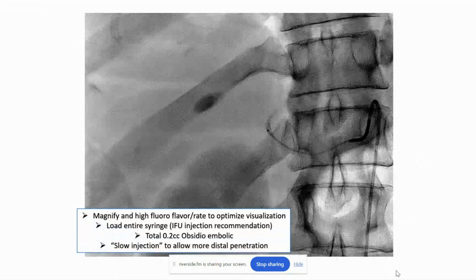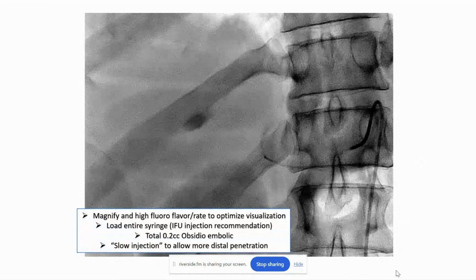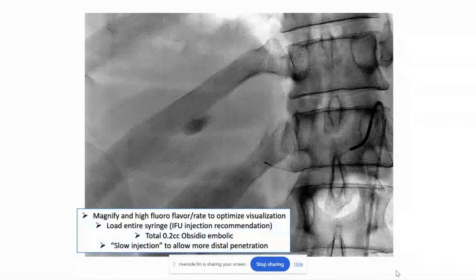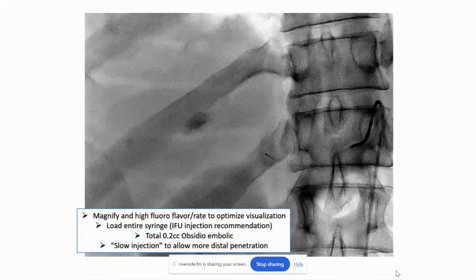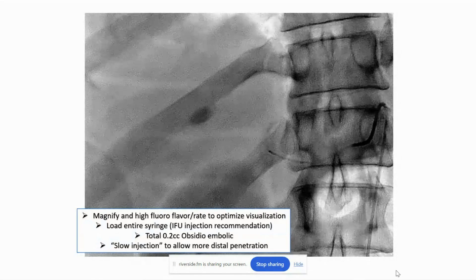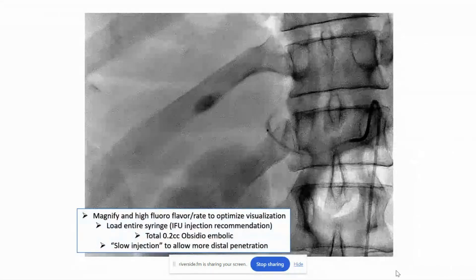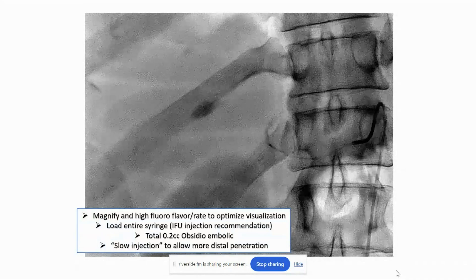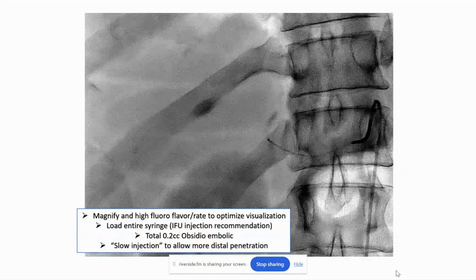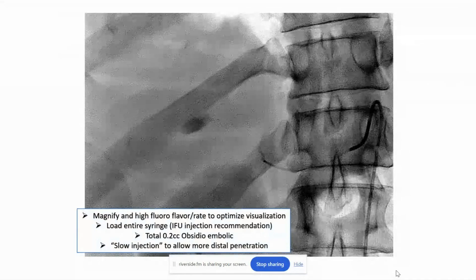So just the pearls: really want to magnify and use a high fluoro rate to optimize visualization. I typically use the IFU method for injection of Obsidio, which is to essentially load the entire microcatheter with Obsidio. The alternative method is to use what's called the aliquot or bullet method — take a small amount, like 0.1 or 0.2 cc's, and then push it out with saline.